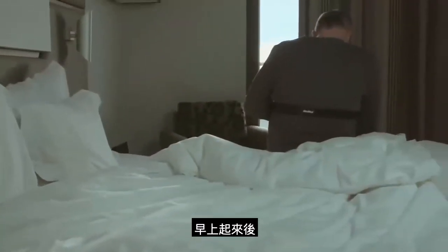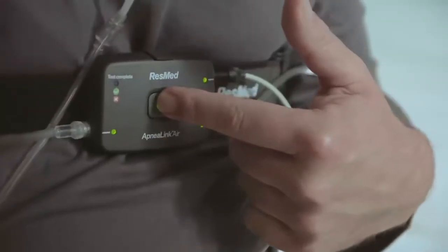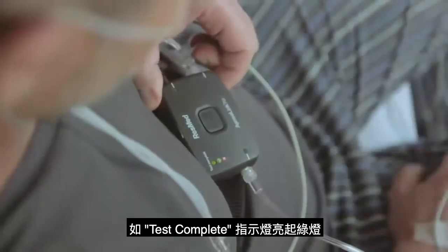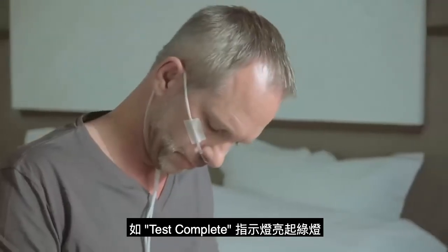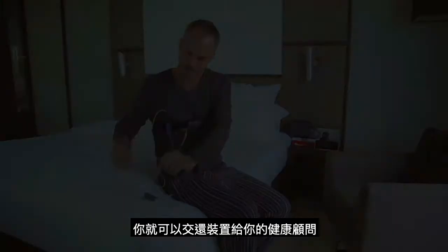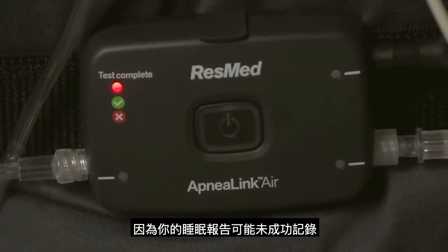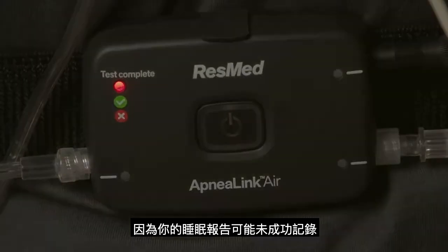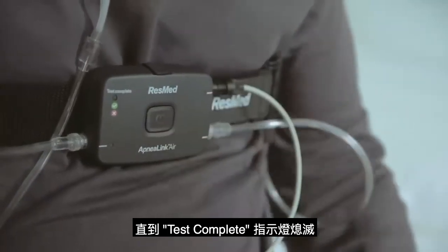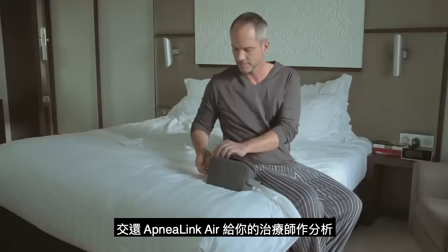When you wake in the morning, turn the recorder off by pressing the button for three seconds. The light will turn off. If the test complete light goes green, you have successfully completed your overnight study and can now return the device to your health care provider. If the test complete light is red, contact your health care provider as the test may not have been successful. Press the on/off button another time until the test complete light turns off and return the ApneaLink Air system to your clinician for the analysis.